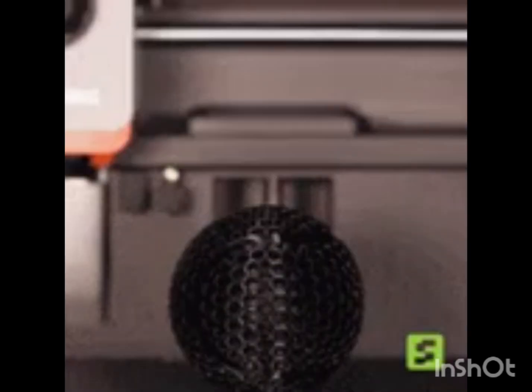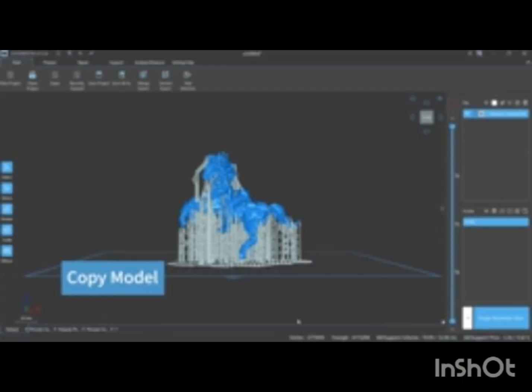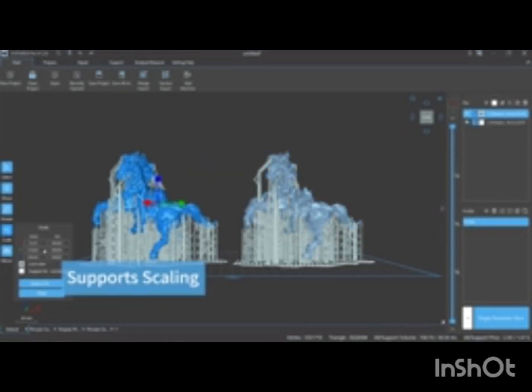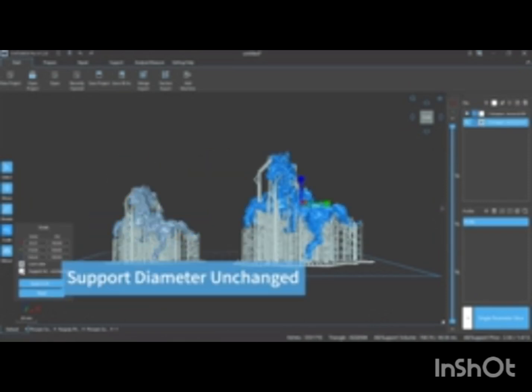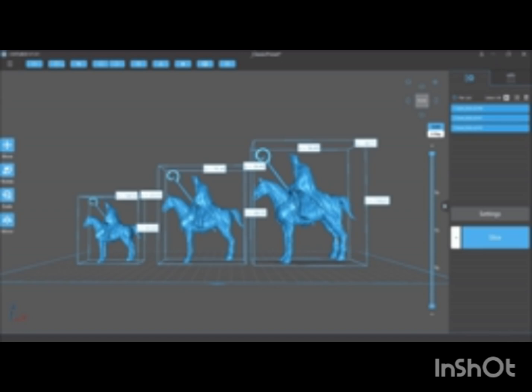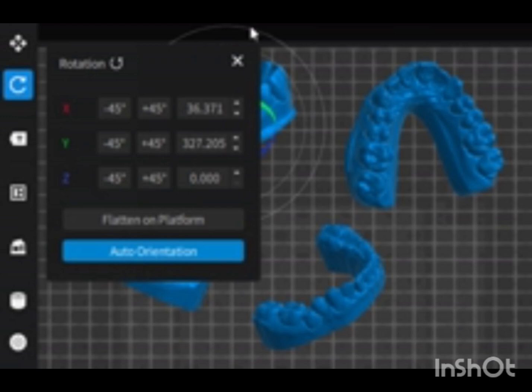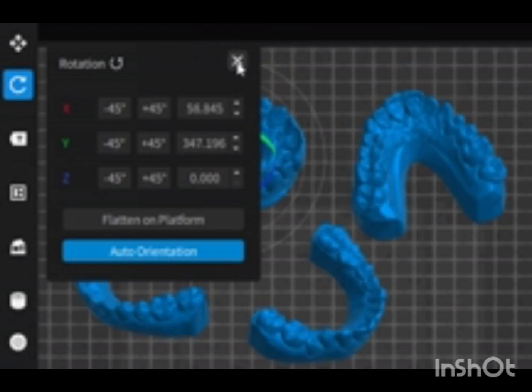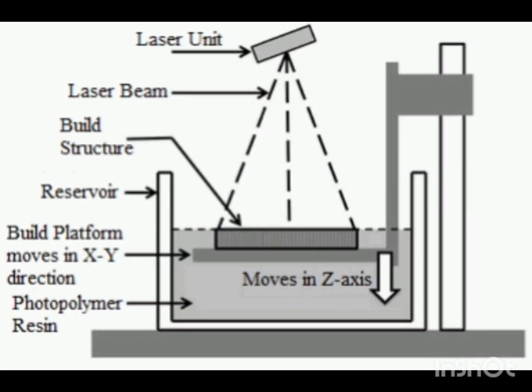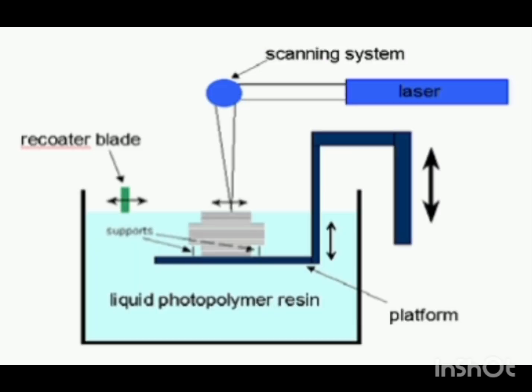In dentistry, the digital model is first obtained using an intraoral scanner or a laboratory scanner, and the model is saved as an STL file, then prepared using slicing software and then sent to the 3D printer. And then the printer builds the model layer by layer by using a light curable resin. This technology has significantly improved the speed, accuracy, and efficiency of digital orthodontics.